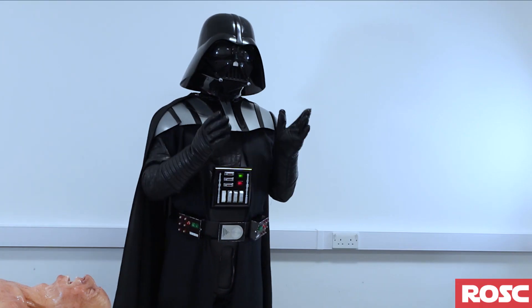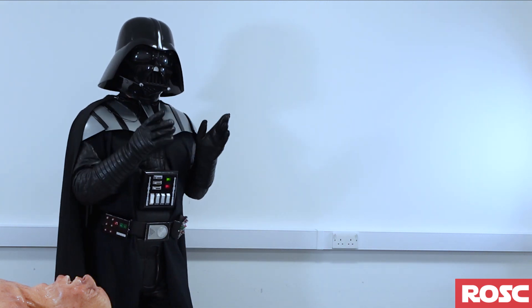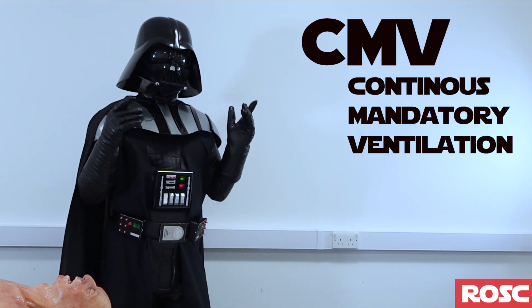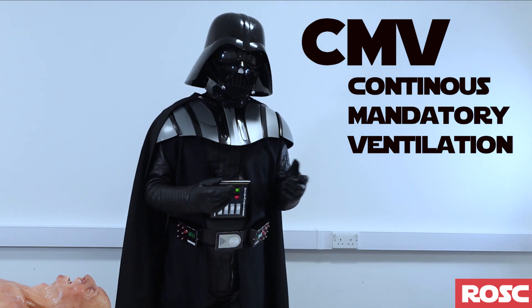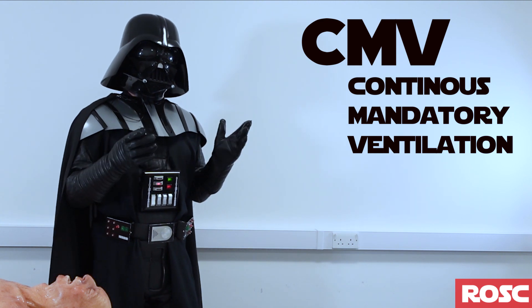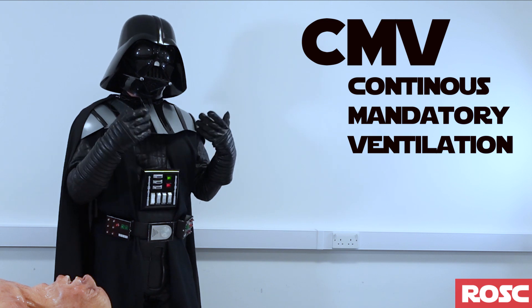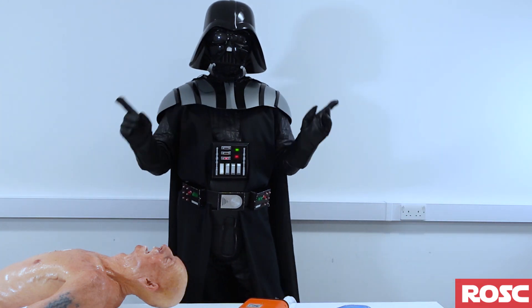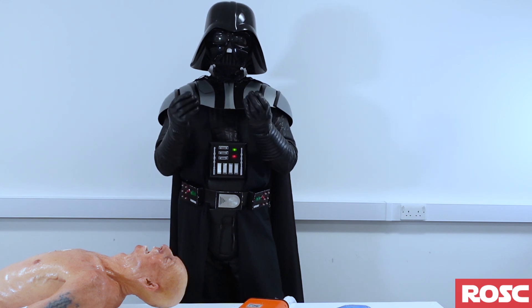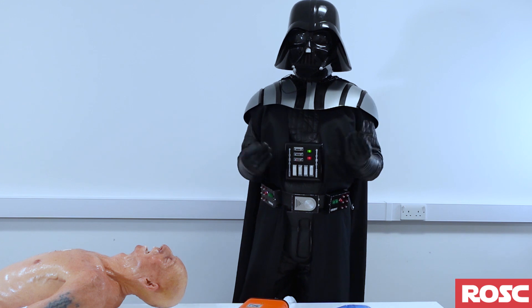Now ROSC — return of spontaneous circulation. The majority of studies support the use of CMV mode, which stands for continuous mandatory ventilation, also known as assist control. In simple words, the patient triggers the ventilator and the machine supports the breathing to reach the programmed value. Remember that you want to treat the patient, not the monitor — so do not stare at the monitor, stare at the human being and treat what you see.